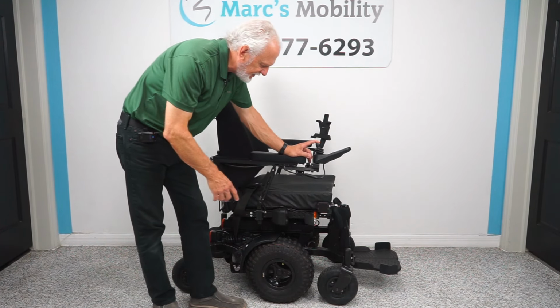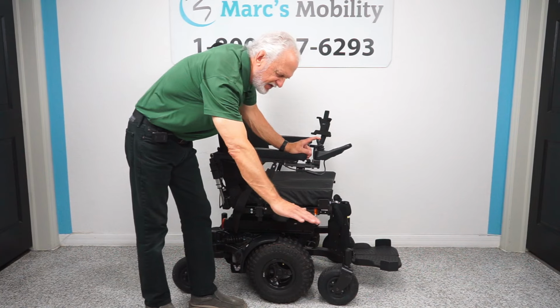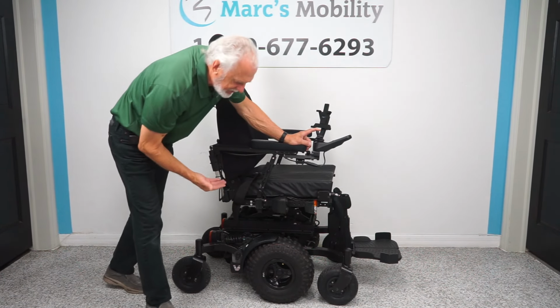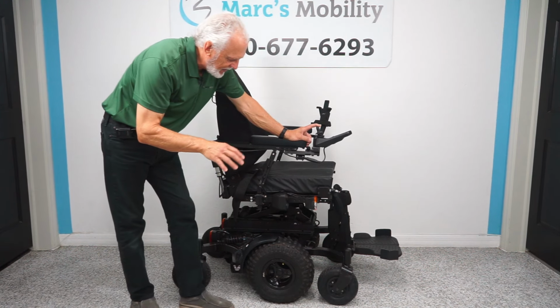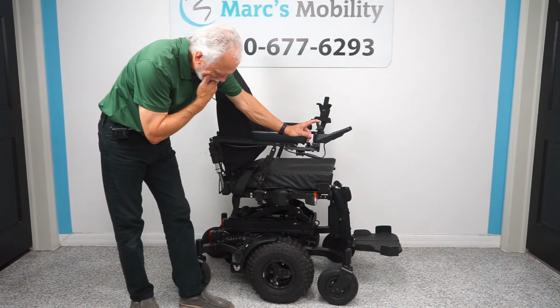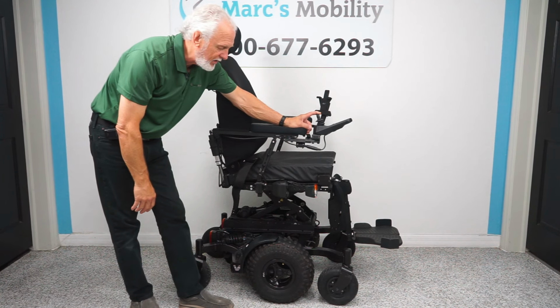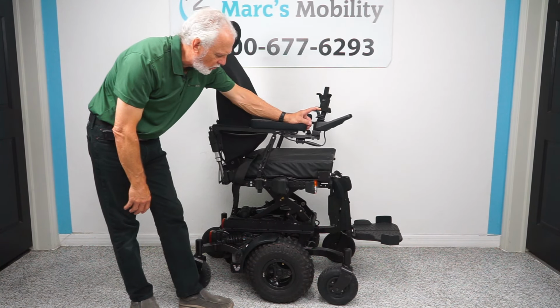So this one here, when the seat lift is down, you're probably gonna be about 23 inches, okay? It's a little higher than most because you have these huge tires. The chair sits off the ground higher. So now your seat lift is going up. You're gonna start at 23. You're gonna add the rest. You'll be at 35 inches by the time you're all the way up.